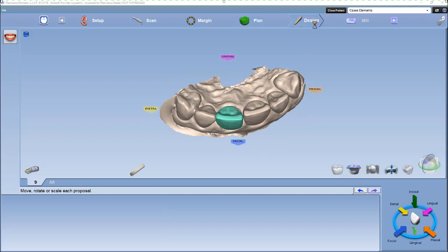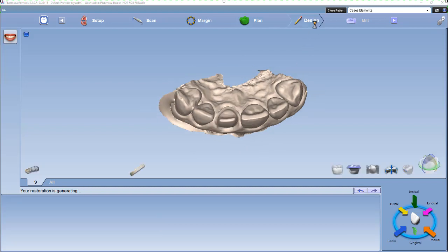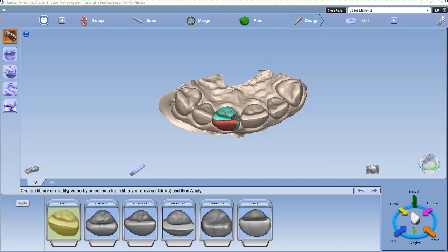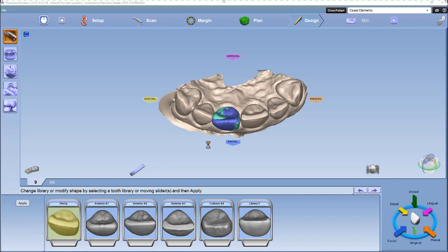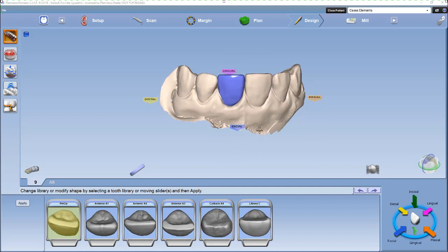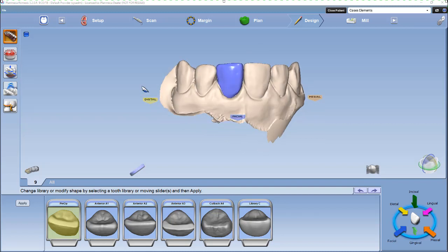Then we'll go to our design tab. You'll notice since we selected pre-op, it's already highlighted pre-op, so all we have to do is hit apply. Once the tooth is applied, you'll notice that tooth number nine morphs in to look like tooth number eight, and then you can use the design tools to adjust the tooth as needed.